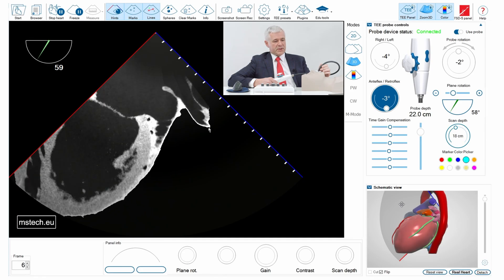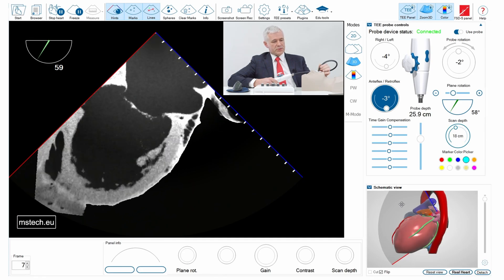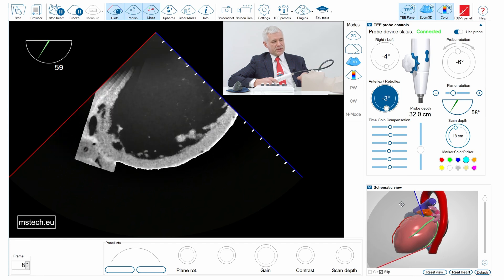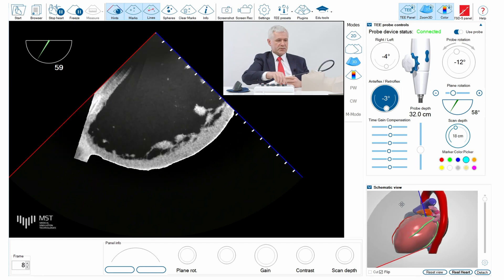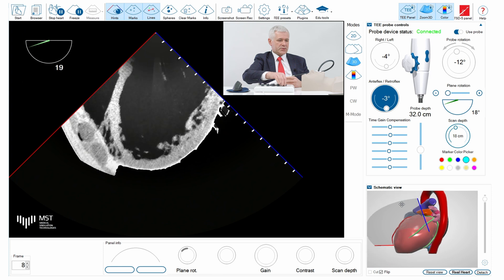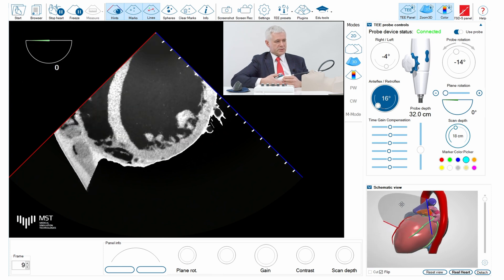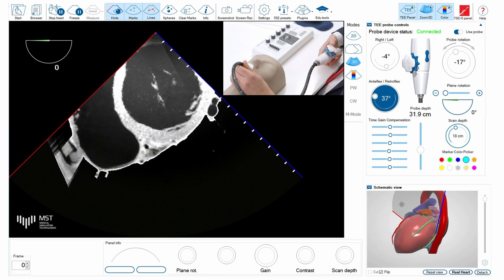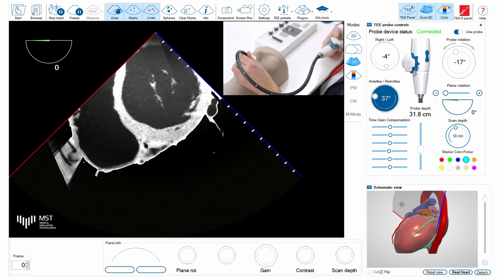Not only the midoesophageal views but of course also transgastric views can be practiced. Now I will just turn to zero degrees and here you can see the short axis view of the mitral valve.